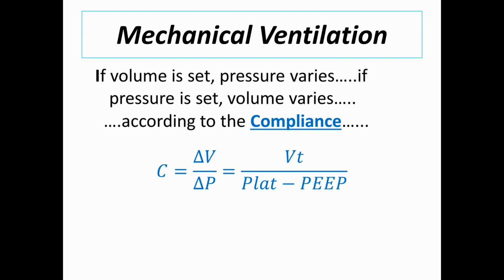Now, at some point, as you increase PEEP further, there will be no change or a slight increase. At that time, we know that you reached your highest distension in the lung, and you go backwards one step. After all, at least in the ARDS literature, if you are able to achieve a driving pressure that is below 15, it is associated with better survival.